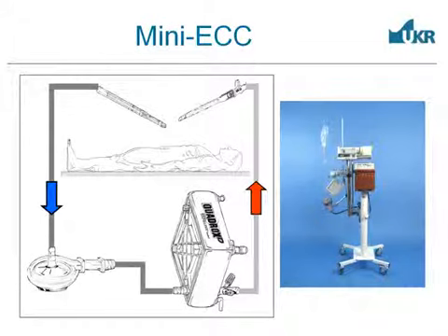Now coming to the mini ECC, this is the circuit, the Maquet system called the MECC system, which we use in Regensburg on a routine basis. It's very, very simple and very basic. It consists of only two components: the Rotaflow centrifugal pump and the Quadrox oxygenator. For this mini circuit, it's a very small setup.